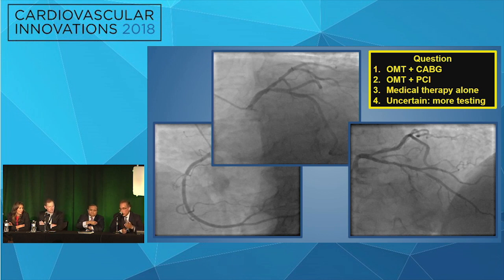The reason I like to get both iFR and FFR is I like consistency of data. If you have a questionable story, moderate lesions, or an equivocal result on one of those two, then I really need more information. But if they're all consistent in a single direction, that just gives you more validity. So I generally do both, iFR and FFR, in this day and age.